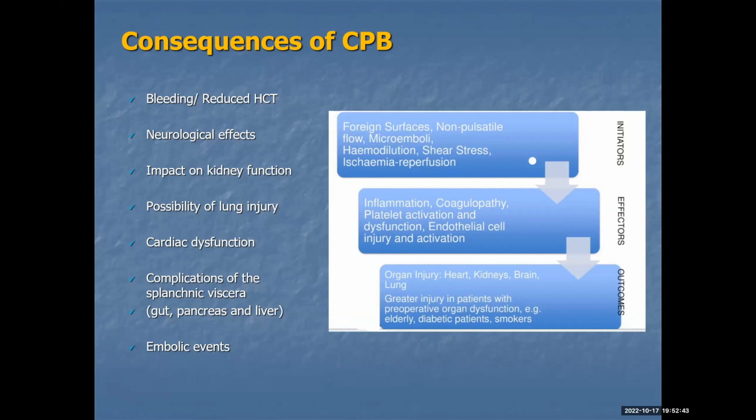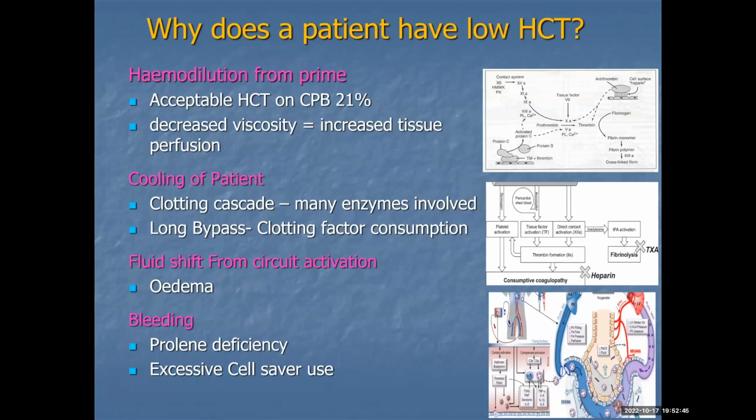But after telling you what the patient has gone through from a cardiopulmonary bypass point of view, and putting the circuit together, I just want, if you ever see a patient on the unit after they've had an operation, for you to have an appreciation of what they've gone through. If you have a patient on the unit with a low hematocrit, think about what's going on, think about what they've been through.